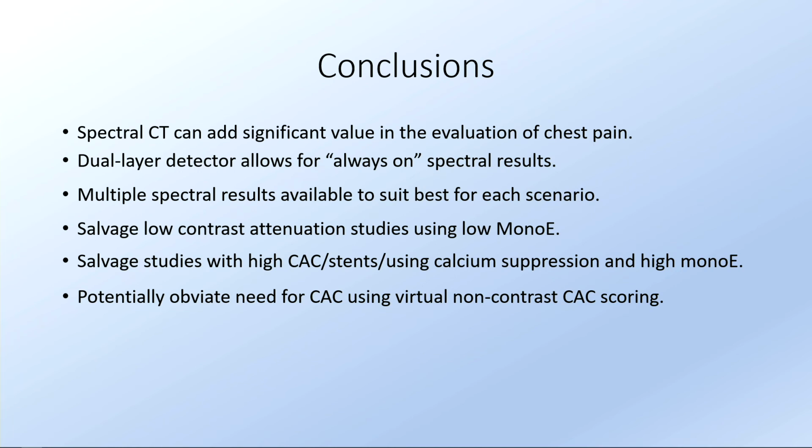I think there's more research that needs to be done on this, but in particular in certain patients, this could be used to give you an idea of a burden of disease, and as we know now from the new CAD-RADS guidelines, also the value of putting in your report the burden of disease and the importance for the referring doctors to know how to treat this with all the lipid-lowering medications that we have and other therapies.